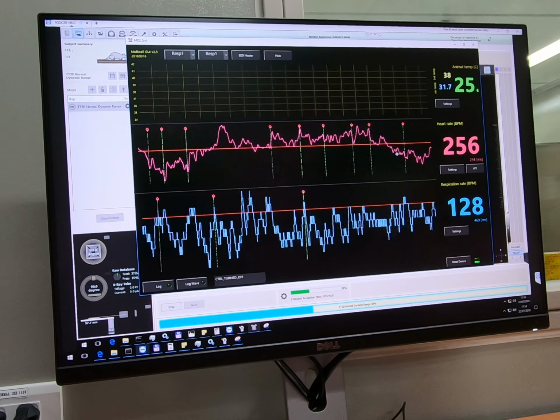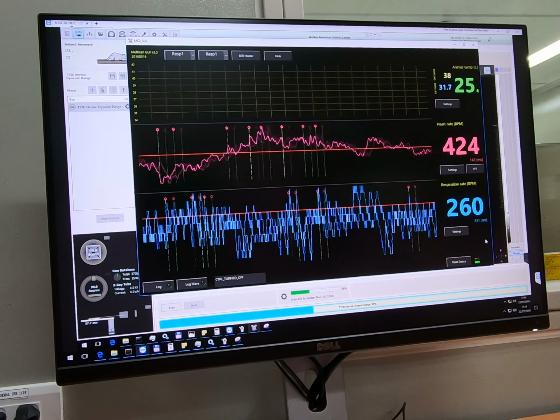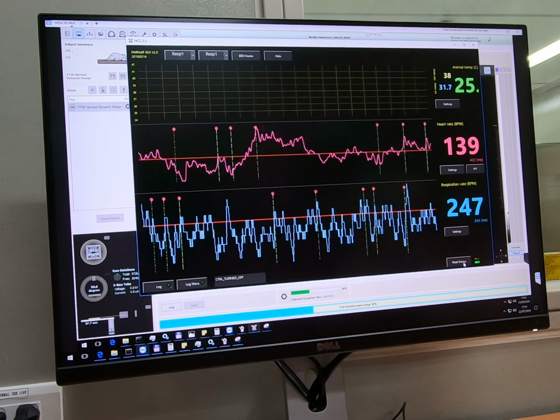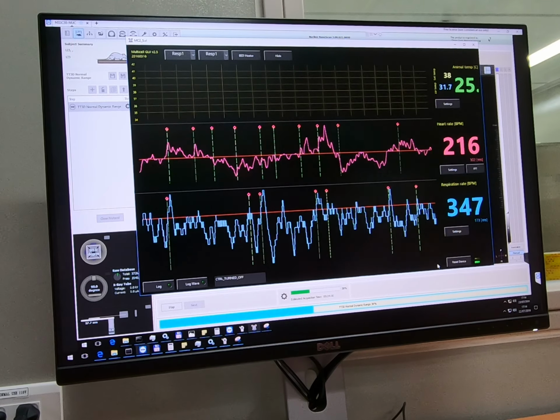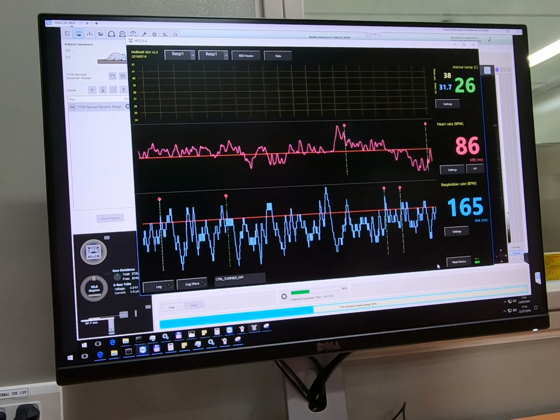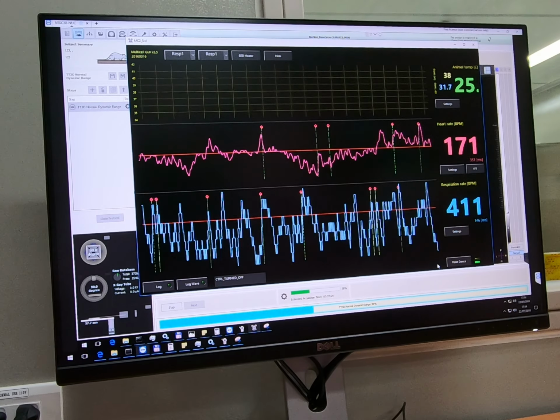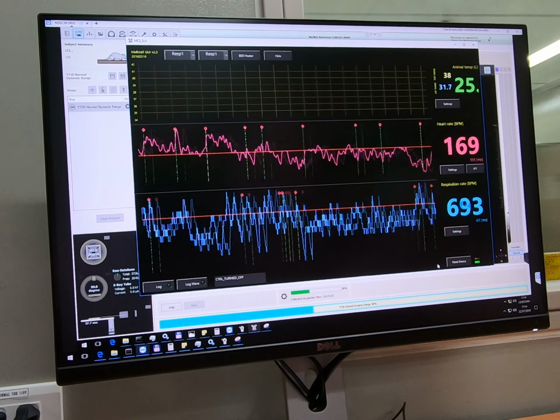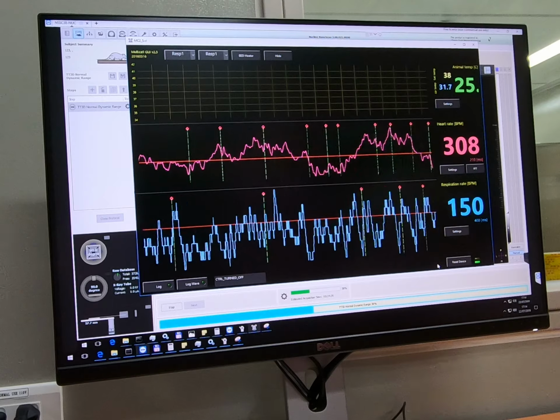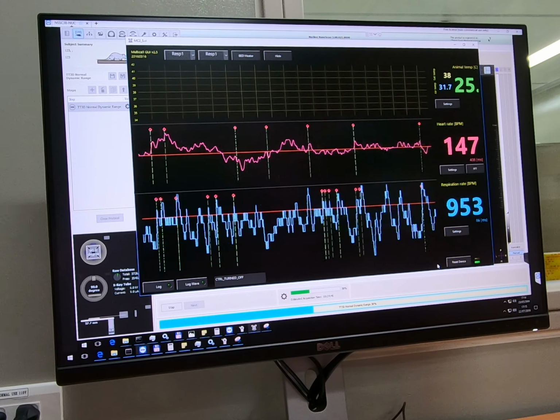Okay, and if you miss some information, like temperature curves, just press the reset device. There is a multi-cell controller inside the gantry, something like what I mentioned regarding the gantry computer. It somehow resets that device, and the signal just magically comes back.